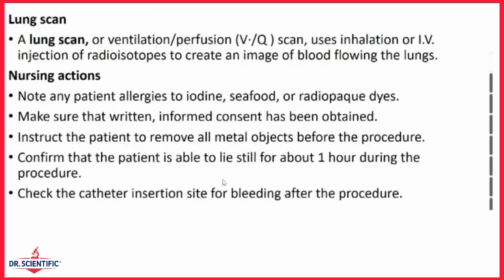So, but before doing the procedure, note the patient's allergies to iodine, to seafoods or the opaque dyes, because that will be contraindicated if the patient is allergic to that. Get an informed consent, remove all metallic objects from the patient before doing the procedure.